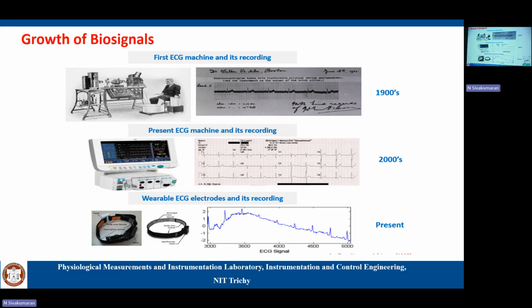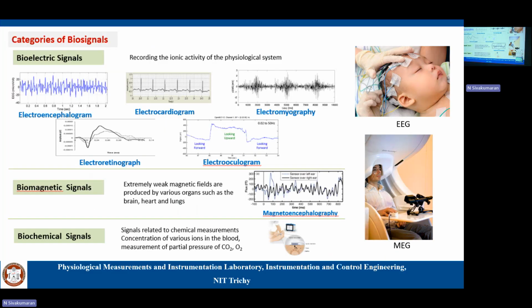But now you can see the ECG machine like this. Even a watch, we have smart watches. In most of the clinics you can see this ECG. So you can see a drastic change in the technology because of recent advancements.